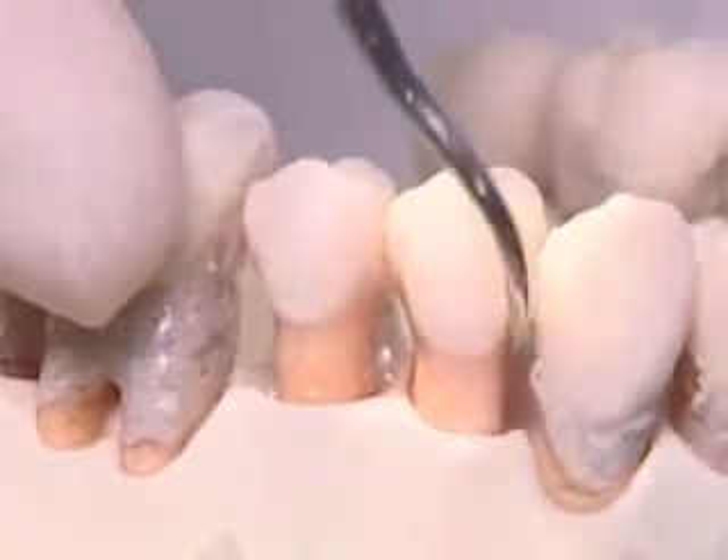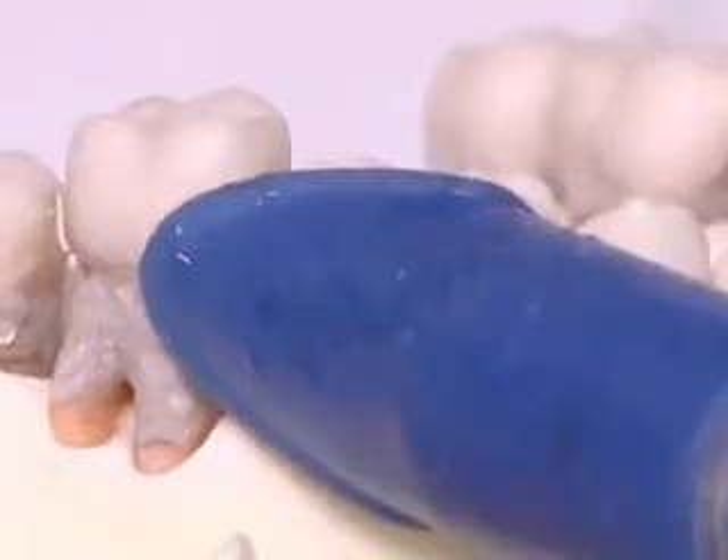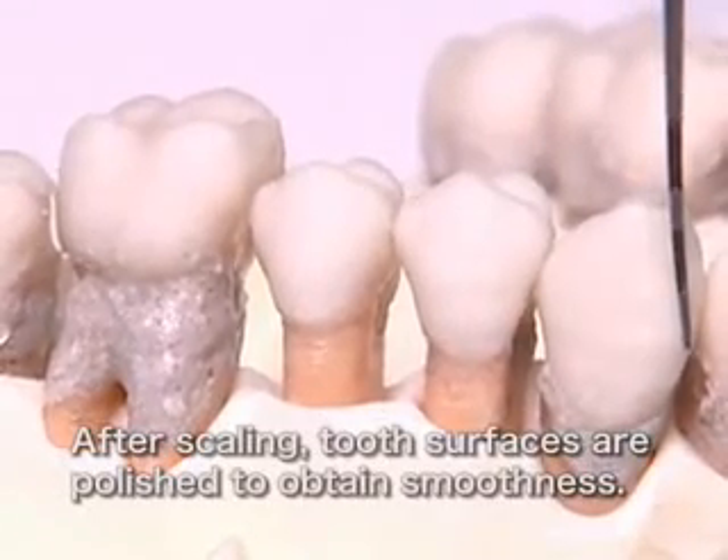Now, calculus is removed from the tooth surfaces. Dental biofilm is removed at the same time. After scaling, tooth surfaces are polished to obtain smoothness.